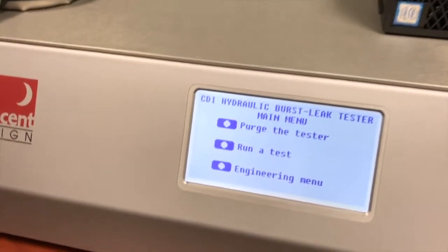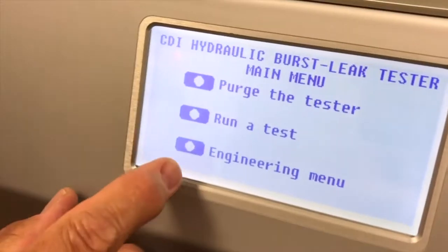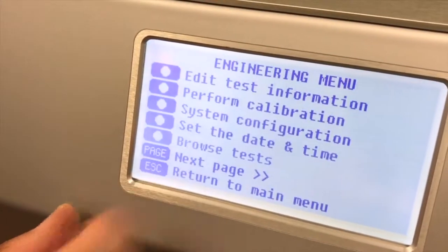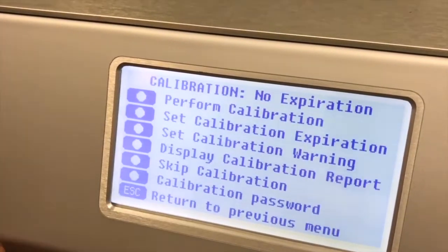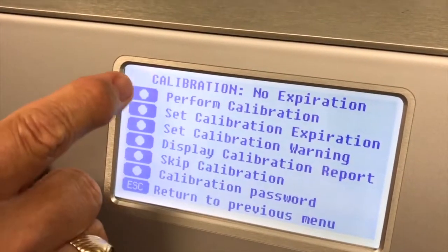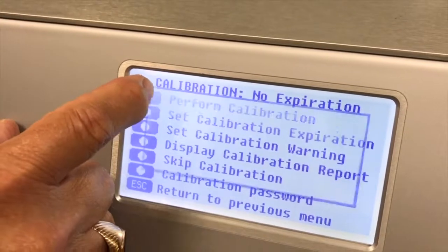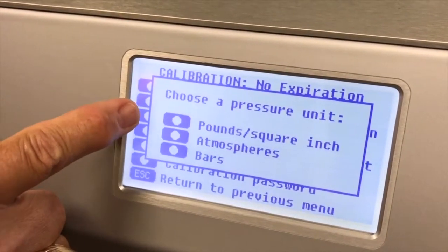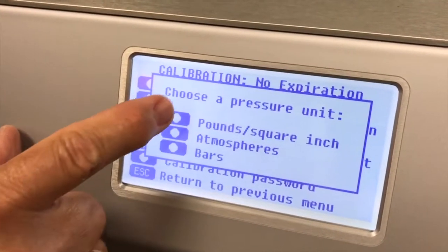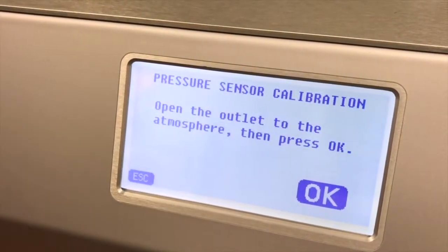This takes you to the main menu. Under the main menu for calibration, we go to the engineering menu — it's the second choice — perform calibration. Here you choose perform calibration again, and you have a choice of three different engineering units: pounds per square inch, atmosphere, and bar. We're going to choose PSI.